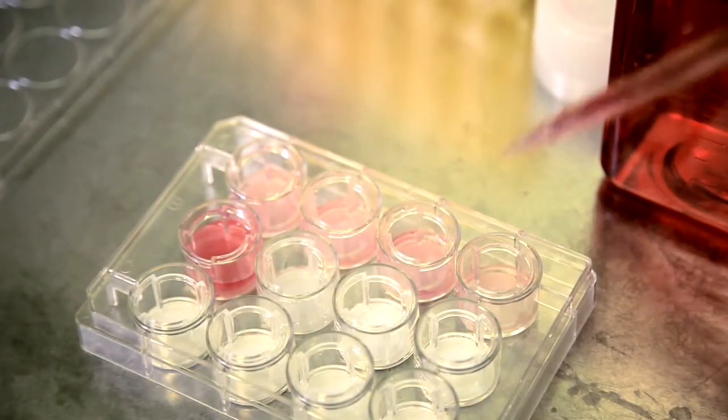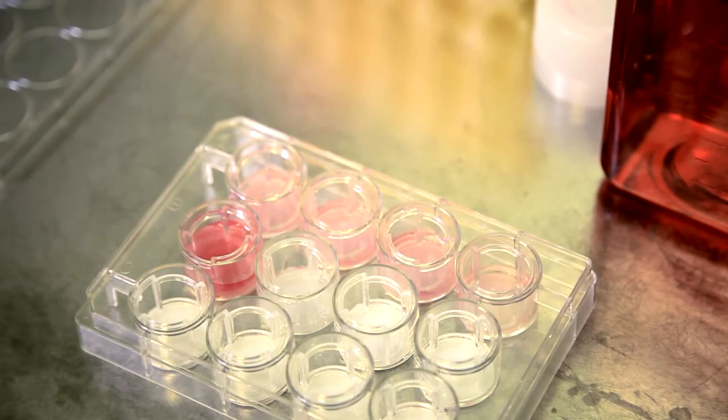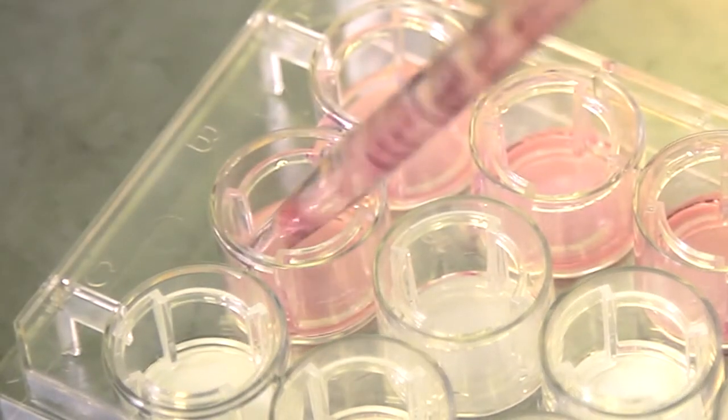After washing, remove the medium or PBS and repeat the process using the same type of medium you'll use for cell seeding.